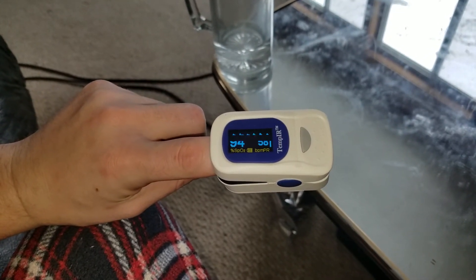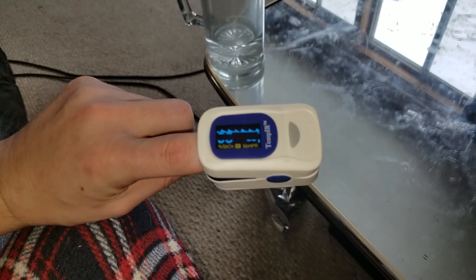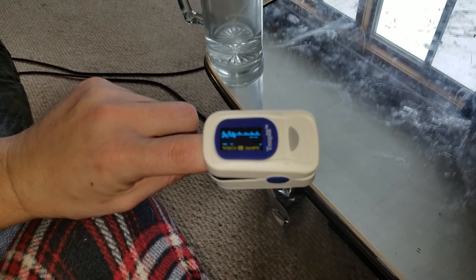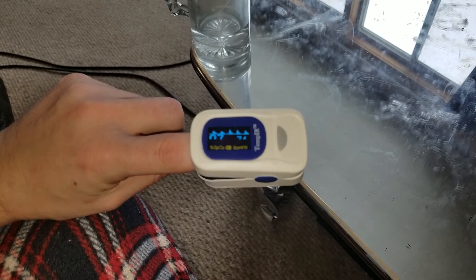Part of being self-sufficient and living on the homestead is you've got to be healthy and be able to monitor your own health. So I thought I'd invest in a little bit of medical equipment here. They're only about $20 on Amazon — I'll leave a link in the comments below.